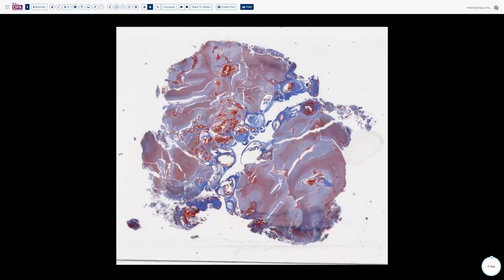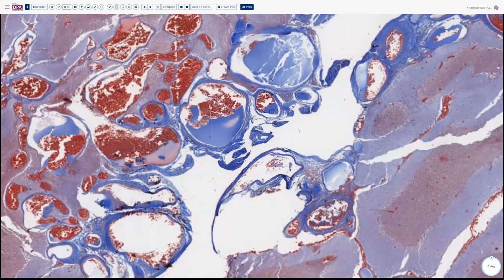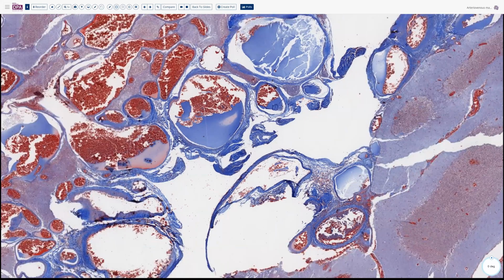And the trichrome could also be helpful for you if you wanted to use that stain as a helpful marker to distinguish the thicker fibrous walled and thin walled vessels. Trichrome has the advantage that it should pick up any muscular arteries that are involved, although not all of these will have smooth muscle in the wall.